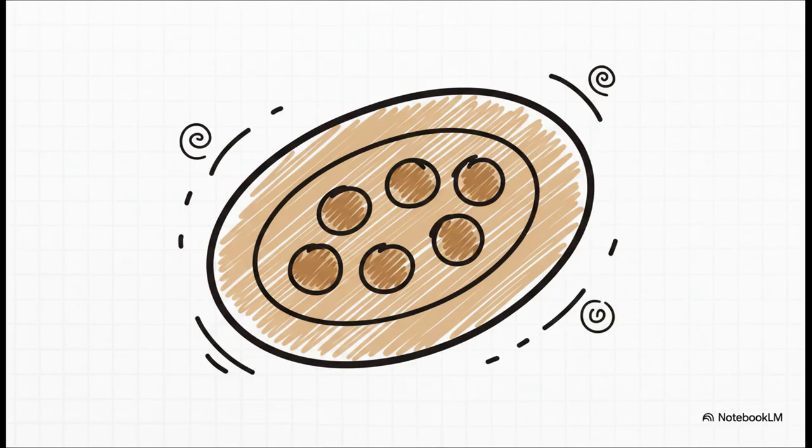Now hookworm, it totally shares the oval shape, the thin smooth shell, the light brown color, and that delicate yolk membrane, but the game changer is that it will consistently contain a countable 4 to 8 blastomeres, no more than that. And it measures slightly smaller in your field of view, at exactly 74 micrometers in length.